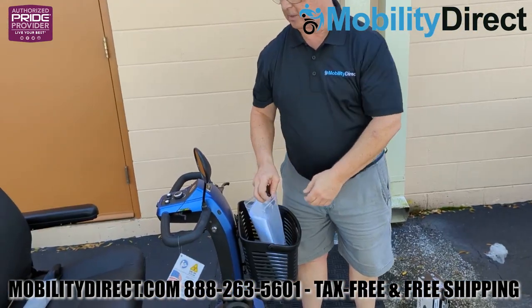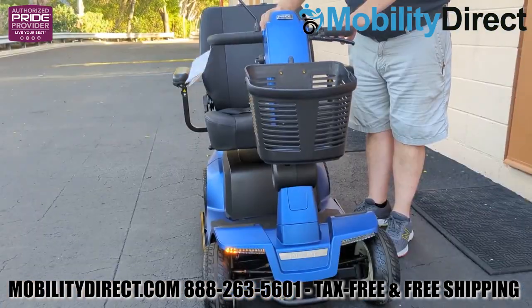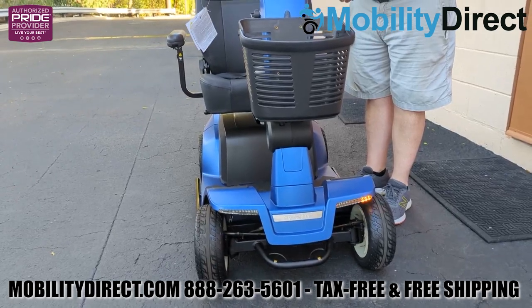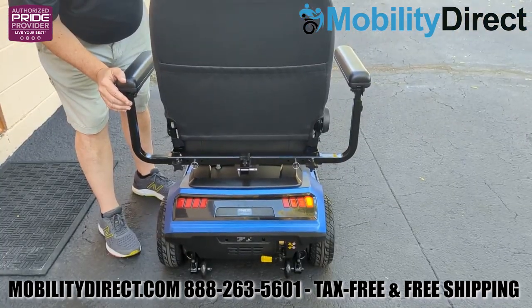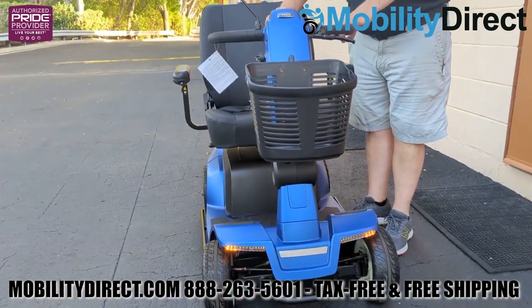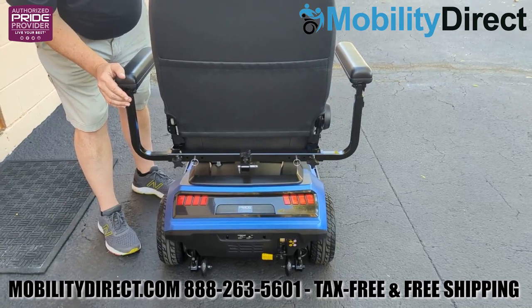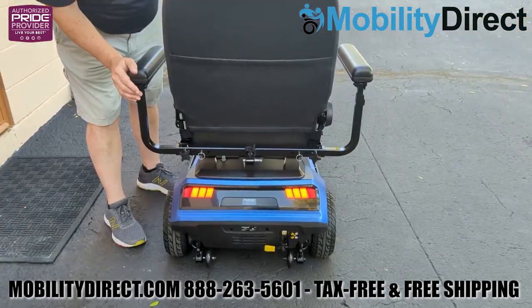Now we're going to show you that the scooter does have turn signals — a left and a right turn signal — which is very nice at nighttime when you want to let people know you're about to turn. We're showing you on the front and the rear how the turn signals look. We're also going to show you the hazard mode, which is just like the blinker but both of them go at the same time on the front and the rear. It also has a standard running light for the front and the rear — these are LED lights, very efficient and bright.